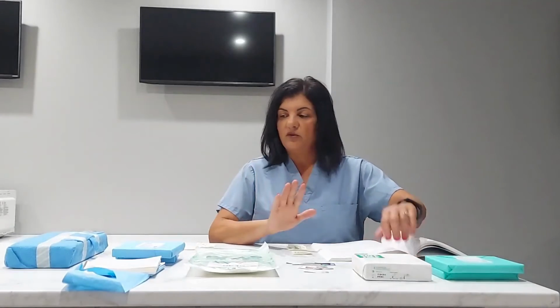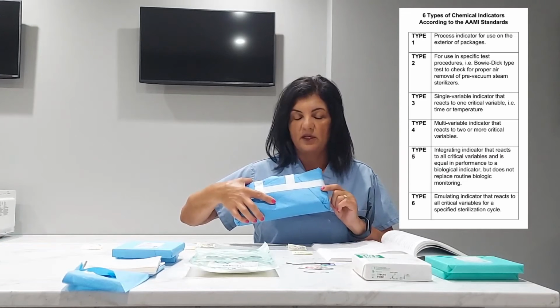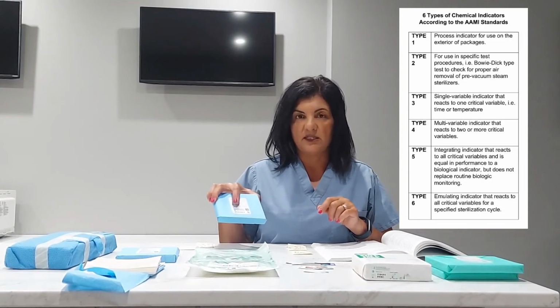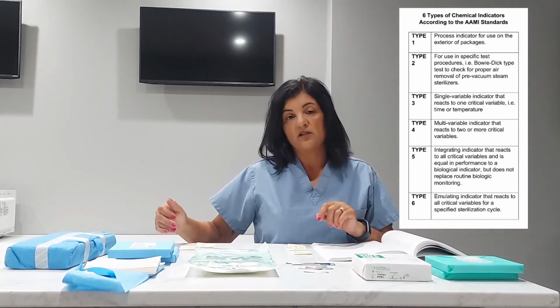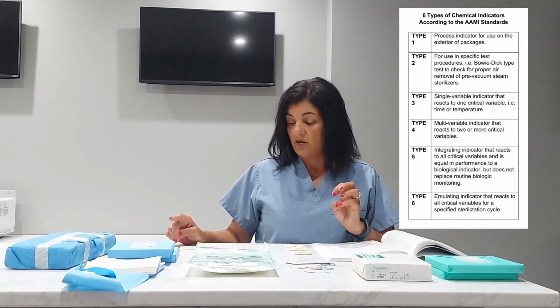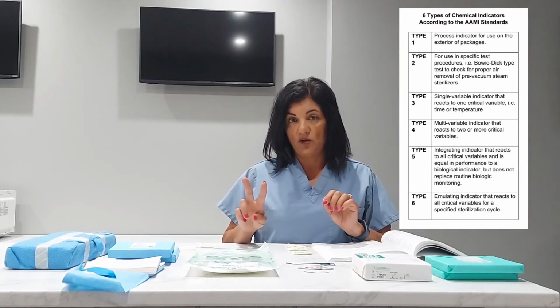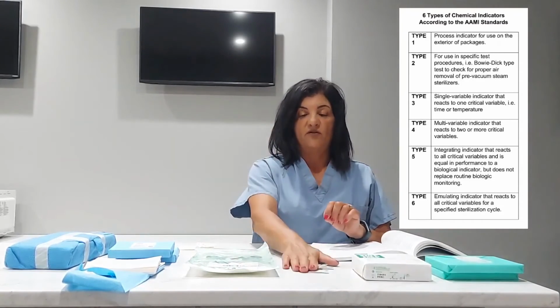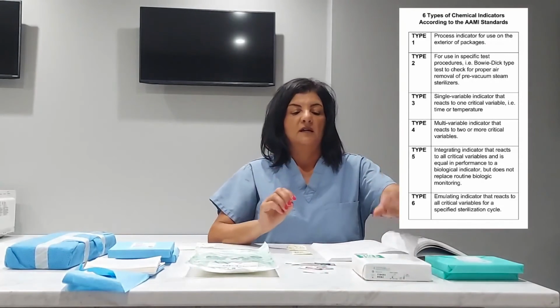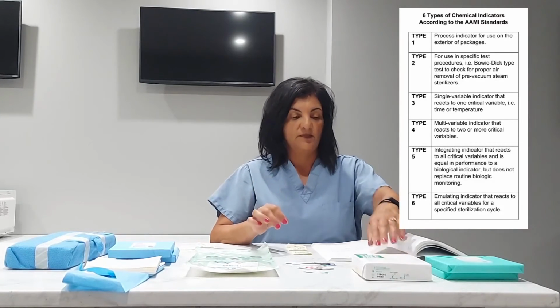So just to review, class 1 is your external tape, exposure to one of the 3 parameters. Your class 2 is typically a test of some sort. Class 3 is designed to react to one of the 3 process variables. Class 4 is reacting to 2 of the 3 process variables. Class 5 is reacting to all 3 variables. And then your class 6 is reacting to specific cycles.